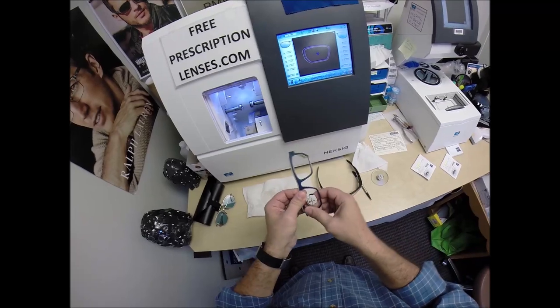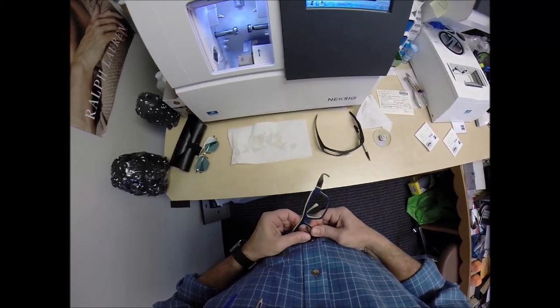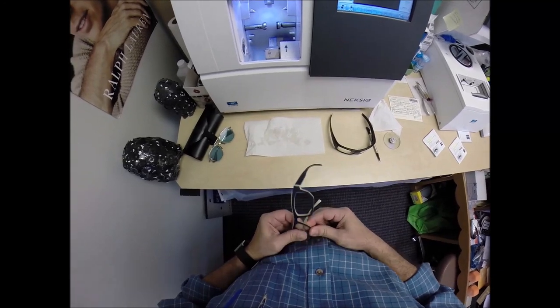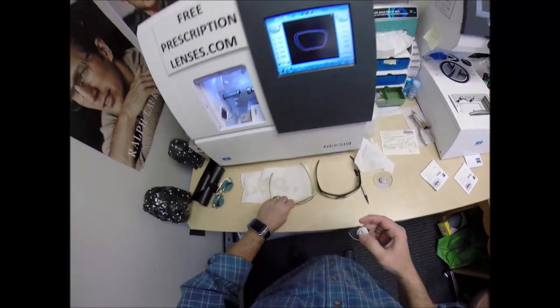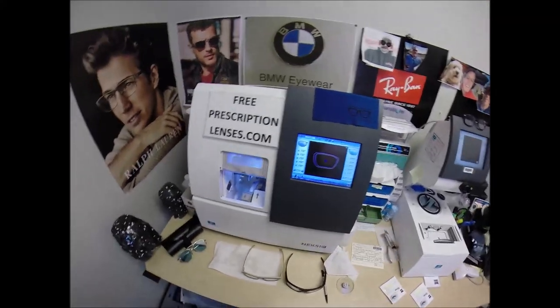Let me tuck this in at the outside corner. It's almost there — a little bit more. No forcing, no forcing. I'll take it down another tenth of a millimeter.